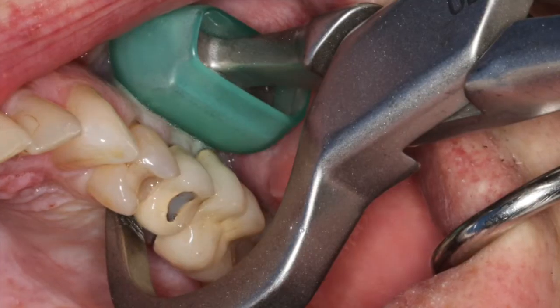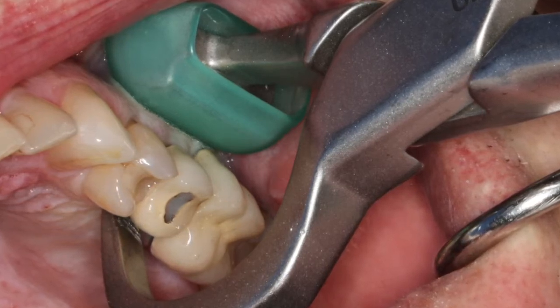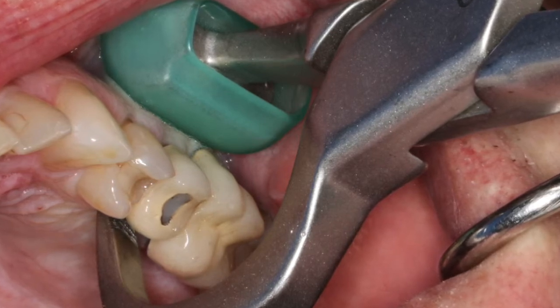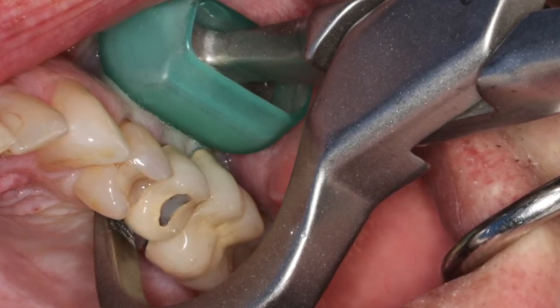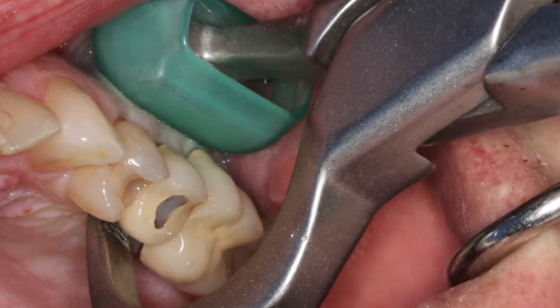The beak is the working end of the instrument and engages the palatal aspect of the root, 1-3 mm subgingival. The bumper is not the working end of the instrument; rather it just serves as a fulcrum to allow us a center of rotation.